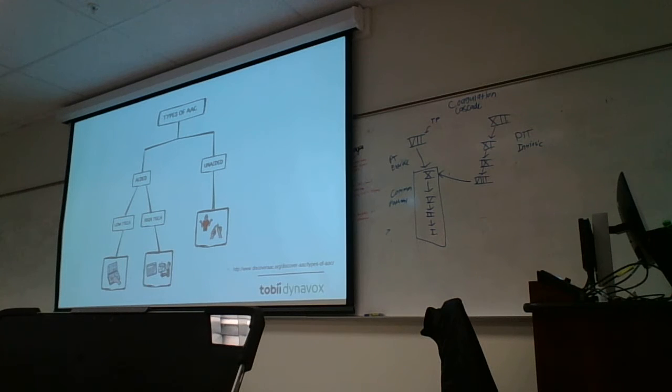So switch scanning is something that we'll take a look at as well. So direct select would be someone that could use their hand on a tablet, be able to access the devices, and switch scanning being able to plug in a switch into a port and then using what's called scanning to be able to access the different cells. And there's different types of scanning within that topic as well. So you can do linear scanning, which means it goes one by one. You could do row column scanning as well, or column row. You could do 2 switch step scanning. So those are all different types of options for scanning.